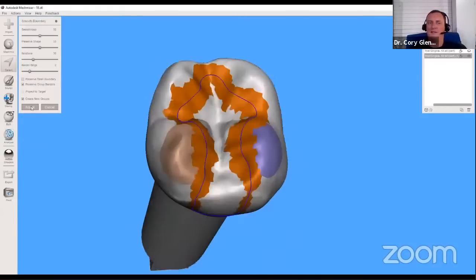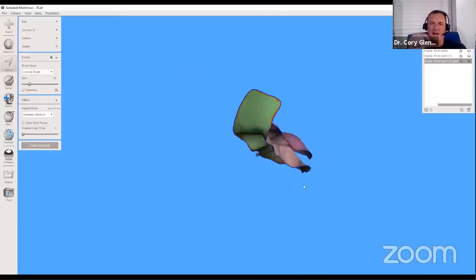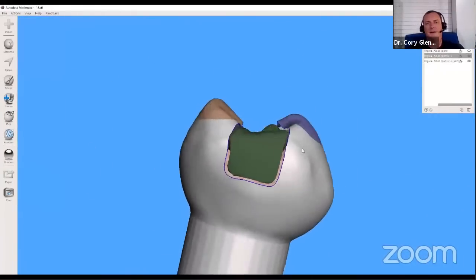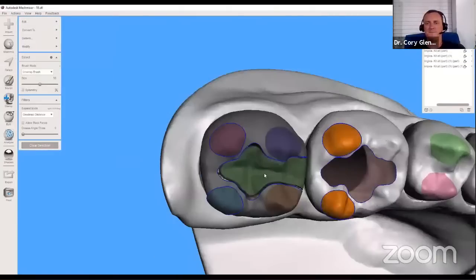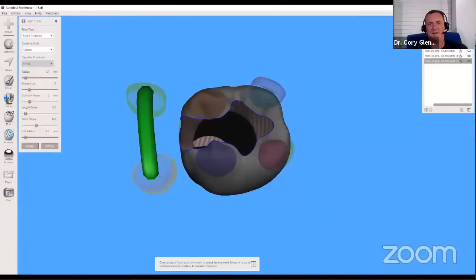But then I have to also create some way of indexing it into place. Because imagine you've got this tiny little inlay and you drop it in and you squish it down through a ton of composite and it's way too deep now, right? That wouldn't work. And so what I did is I created on the adjacent teeth these little indexing feet. And this is, again, the beauty of 3D printing. There's no way you can mill a shape like this.